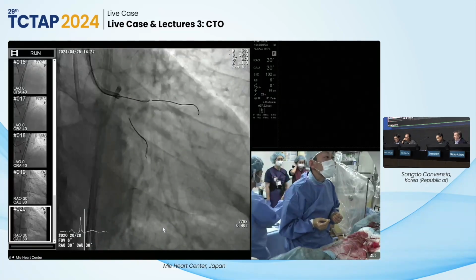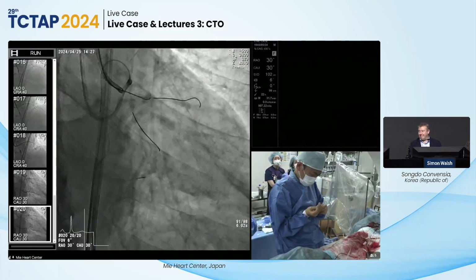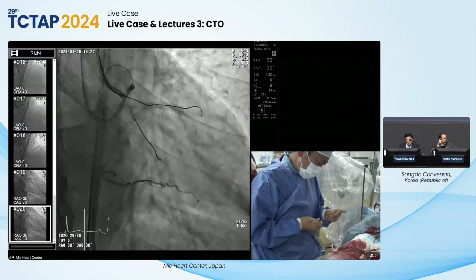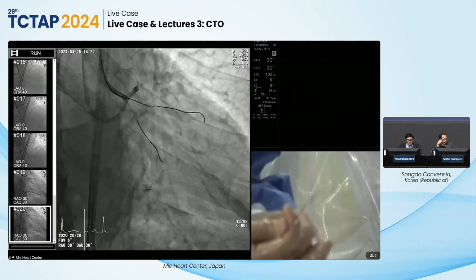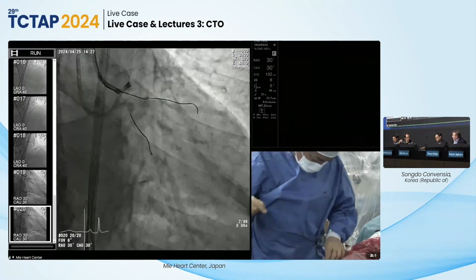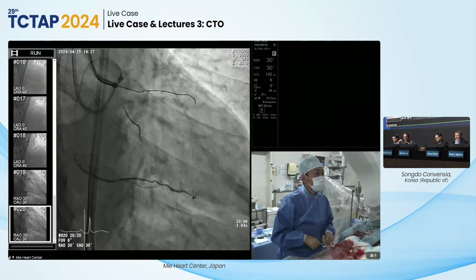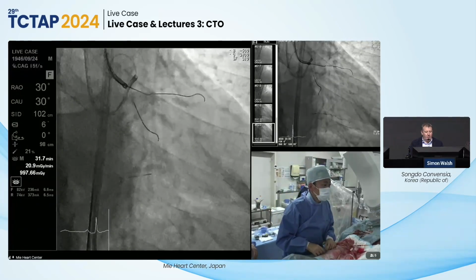Yeah. I think there's no doubt that the more tortuosity the PDA has, the more challenging it becomes. Exactly. It's always the same, right? It's easier from LAD down because the tortuosity of those septal collaterals is almost at the PDA area and not at the septal takeoff. Yeah. So therefore, it's always a little bit more complicated to wire the septals from PDA towards LAD occlusions than compared to vice versa. Right? Less predictable than we like to think. Yeah. Sometimes they look very, very promising, but you just don't get the entry done, right? So it might also be sometimes frustrating. Or you can engage a little bit and the wire prolapses every time you try to go through with the microcatheter. Yeah.